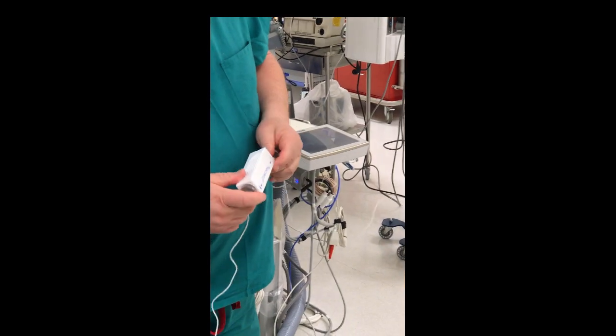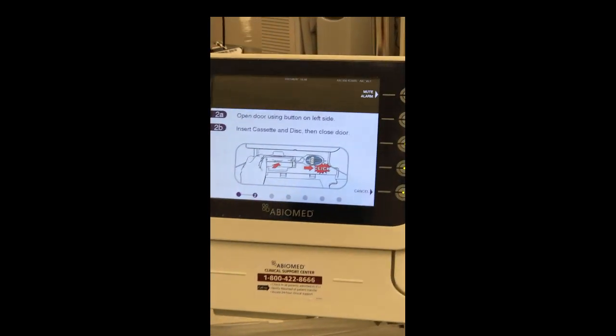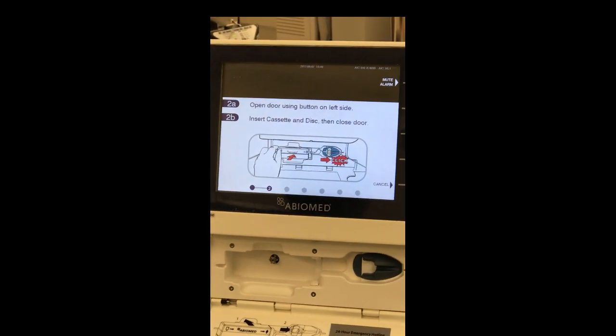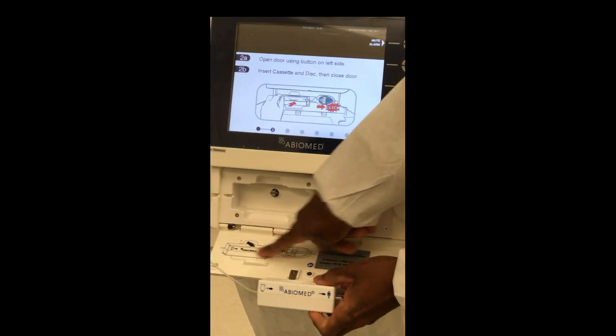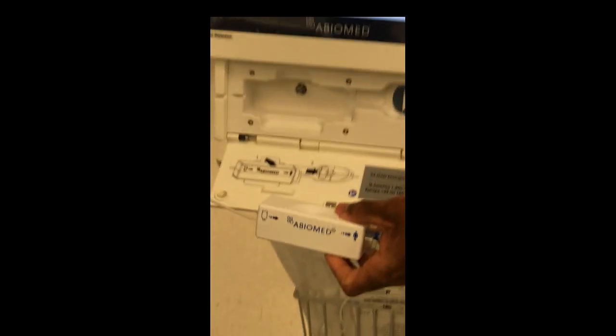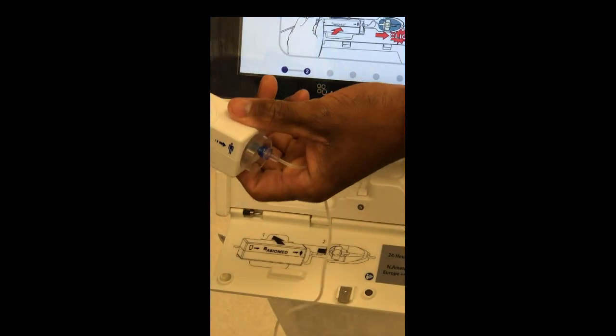What would you guys do next? Hit next. Open door — notice how it shows you a picture of the door. Notice the reference markers here and here. If you're wondering which way the cassette goes in, just follow the picture guide.